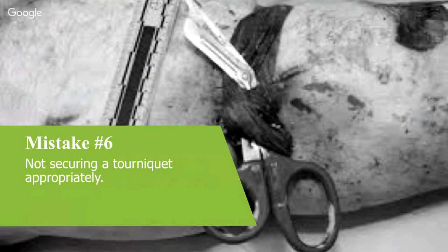Yeah, I haven't seen a CAT in anger fail with the Velcro, but I've certainly seen it in training. I've heard of guys that will get their duct tape. After they apply the tourniquet, with the CAT and the Velcro, they'll then duct tape around it to mitigate that risk of the Velcro coming undone.